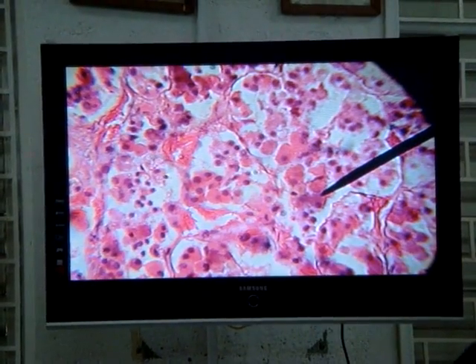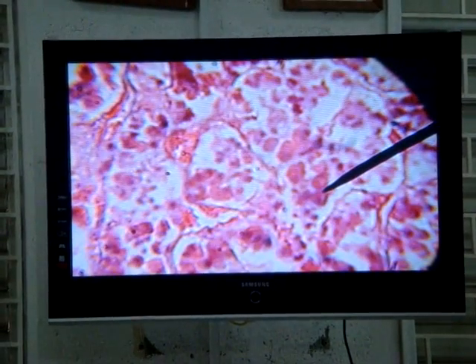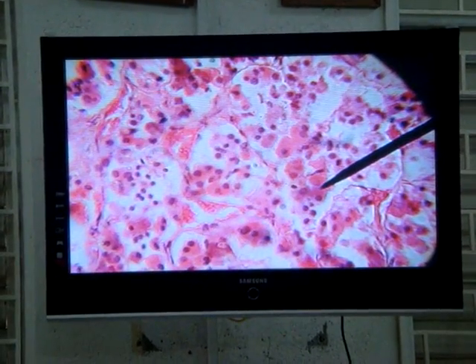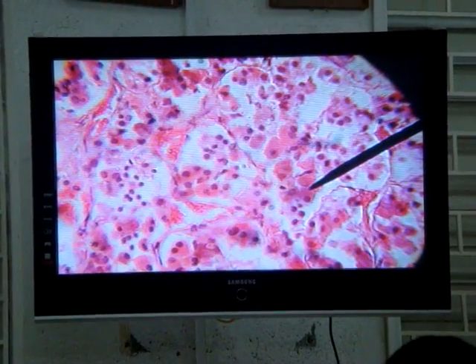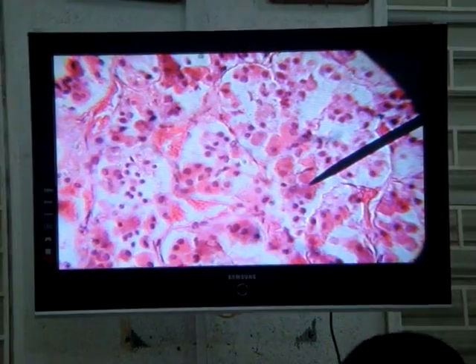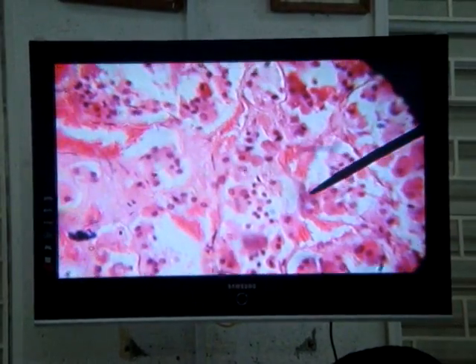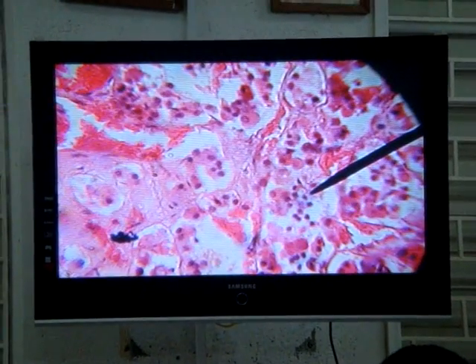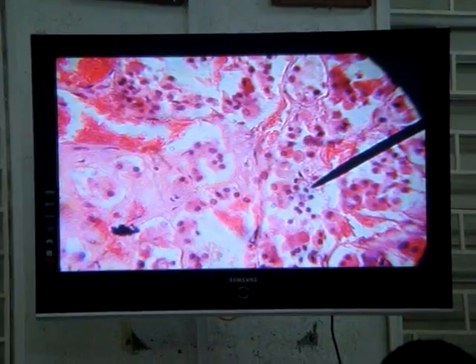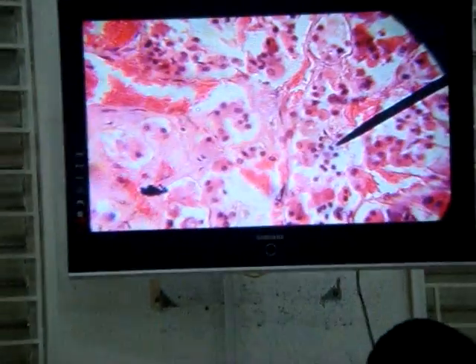The chromophils are the ones with bright, beautiful cytoplasm. Now on the other hand, there are some that don't seem to show much cytoplasm at all. For example, if you look at these ones right there, all these features are nucleus. Those are chromophobes. So we grossly have chromophils and chromophobes.